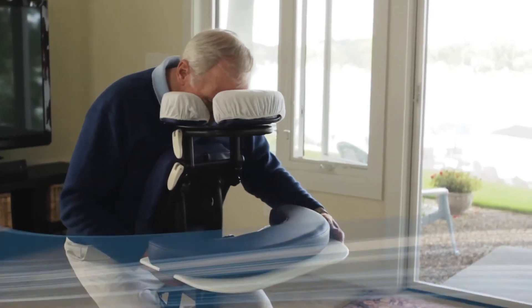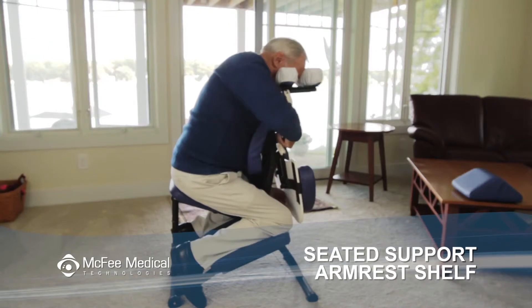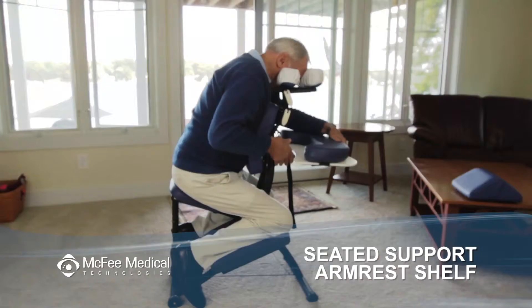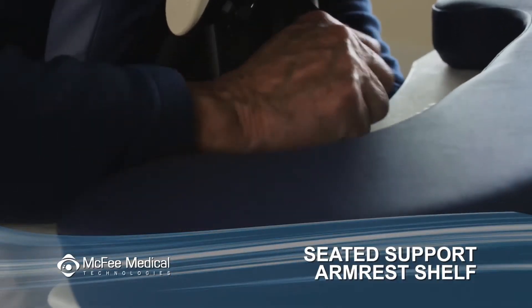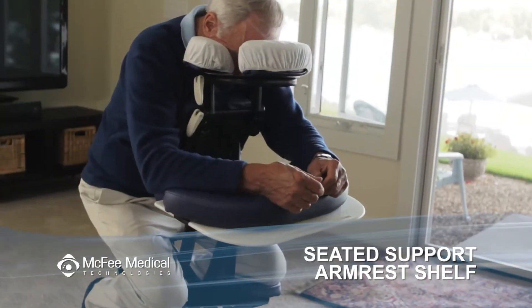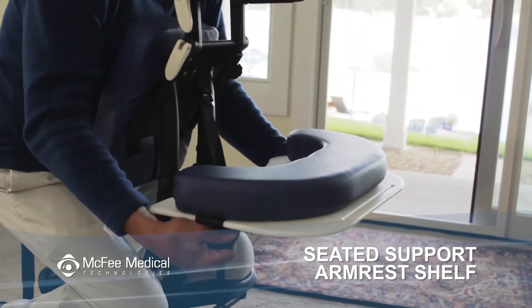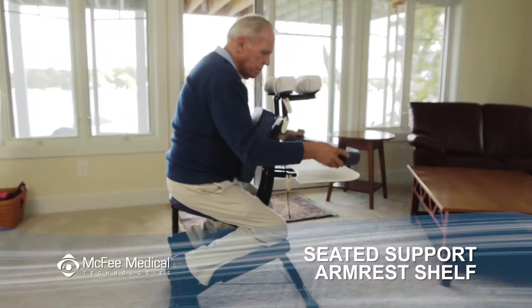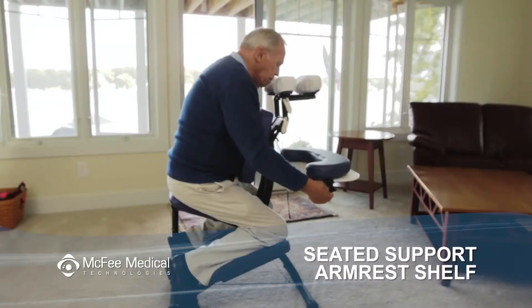To adjust the armrest shelf, release the cam lock and the strap. Move the armrest shelf to the correct height for your activity, lock the cam lock first, then adjust the length of the strap. Using these two adjustment points, you can change both the height and the angle of the armrest. You can also easily remove the armrest pad, which is attached to the armrest shelf with velcro strips on the sides.